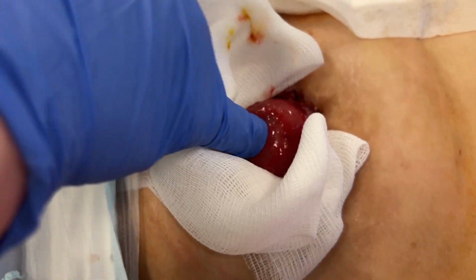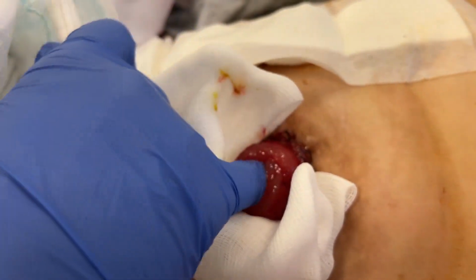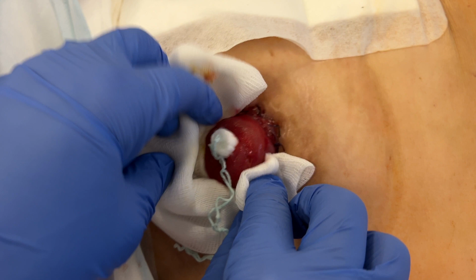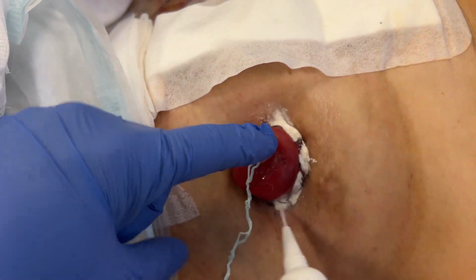If necessary, the passage through the stoma can be checked using a moistened fingertip, performed by a trained stoma nurse or a doctor. The continuous outflow of aggressive intestinal contents can complicate the appliance change. And in cases of narrow stomas, a small tampon may be temporarily inserted by trained personnel.